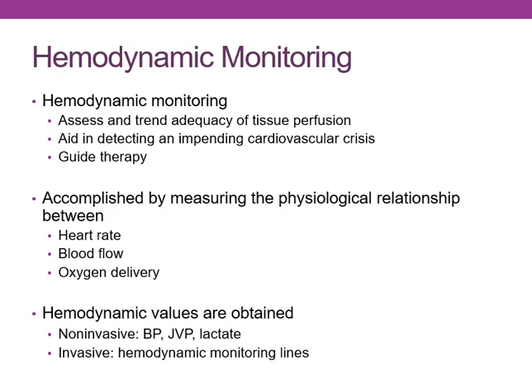And it does guide our therapy because instead of thinking, all right, my patient has a decreased cardiac output problem, and that means that I'm going to have weak, thready pulses and poor cap refill and cool, pale skin, it would take a while for those signs and symptoms to get better. As I give patients medications, I can look at these numbers that adjust within minutes. They update all the time, if not constantly, and I know exactly what I'm doing. So we are looking at the physiological relationship between heart rate, blood flow, and oxygen delivery. So we've got to have all that come together.